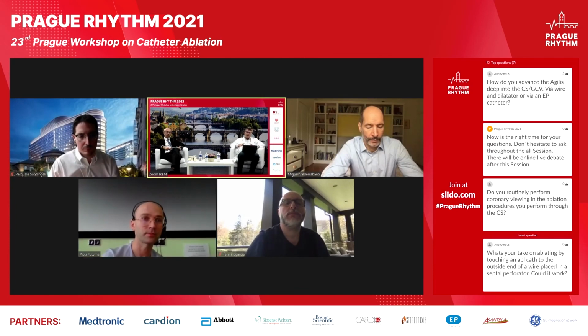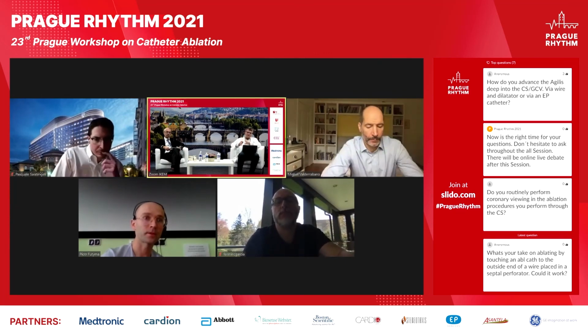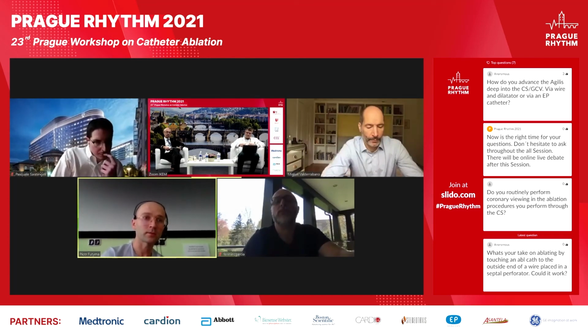All right, thank you. And last question. I understood that you prefer to use 2 irrigated catheters. What is the indication for the usage of 8mm from one side? Well, to be honest, I switch to 8mm when I require higher powers. And basically, if you have a scar, it will protect itself against your radiofrequency, even if you use bipolar ablation.